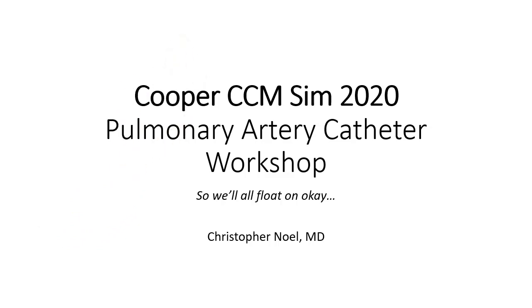Today we're going to talk about pulmonary artery catheterization, the procedure, how we go about interpreting everything, and actually go through a little bit of the history of the catheter and where we got to where we are today.